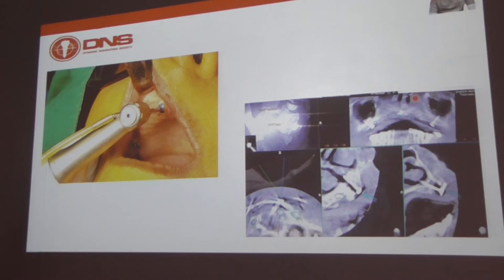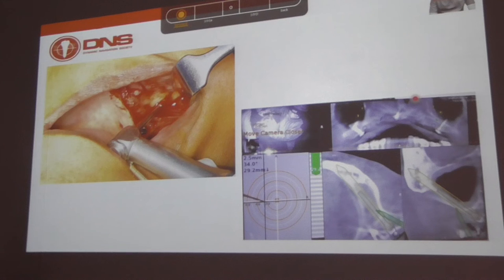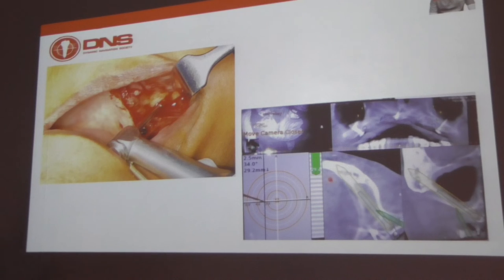Again, every drill is calibrated. Now I'll show you the next, Dr. George. So the first thing I do is calibrate the point drill or the lance drill, or you can call it the precision drill, whichever system you use. And then this is the implant position, the planned implant I am planning.